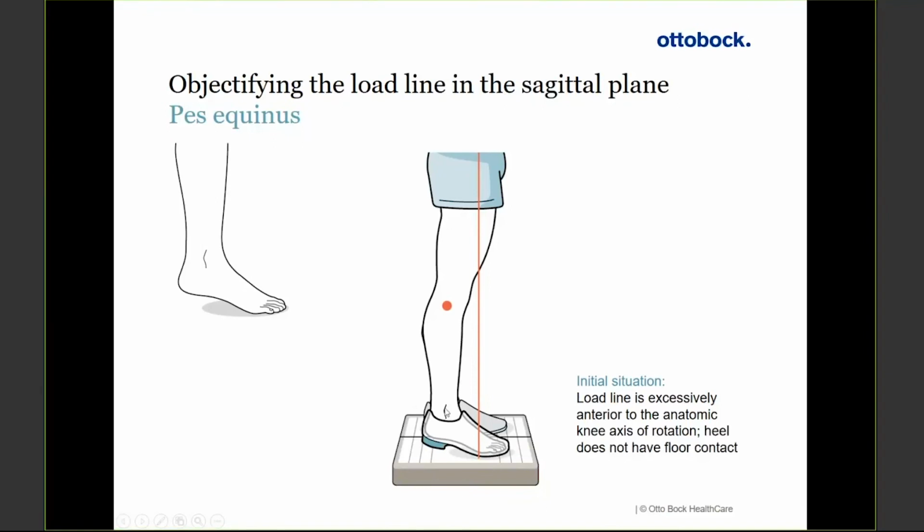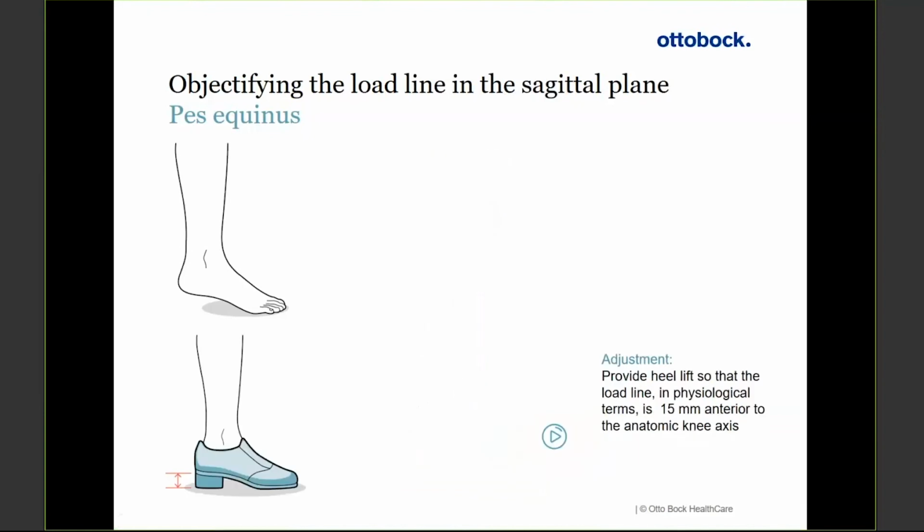So really a lot of what you've already explained, Aideen, is perfectly applicable to orthotics. When we talk about a pes equinus position, you can see what you'd have with somebody with muscular dystrophy, for instance. They are actually on the toe tips, right? And so they're in the pes equinus. What they're trying to do is position the knee so they get more extension. So the L.A.S.A.R posture really shows us where that laser line is.